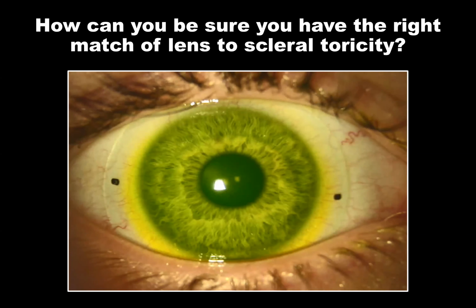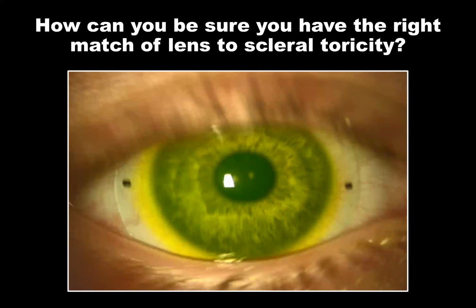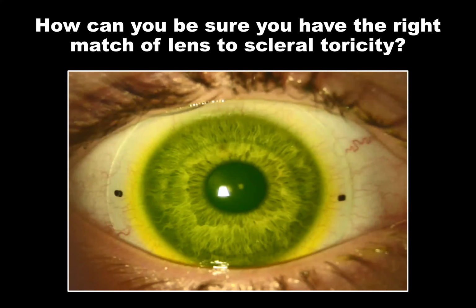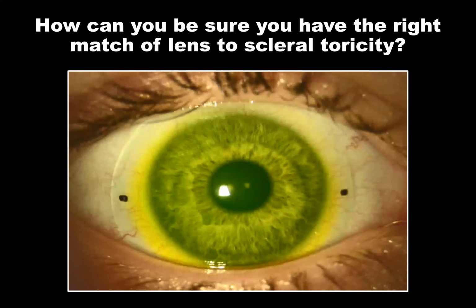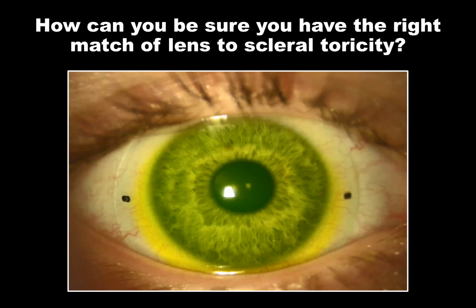I would say generally I haven't heard any comments, probably at least 80 to 90% of the time. I don't think patients are aware that that lens is rotating on their eye. Now there may be some that do, but remember also that the toricity is incredibly subtle.